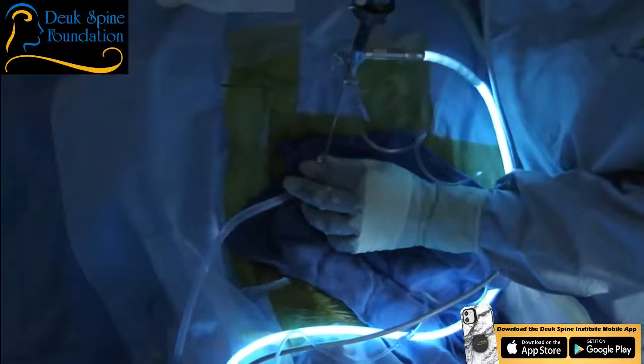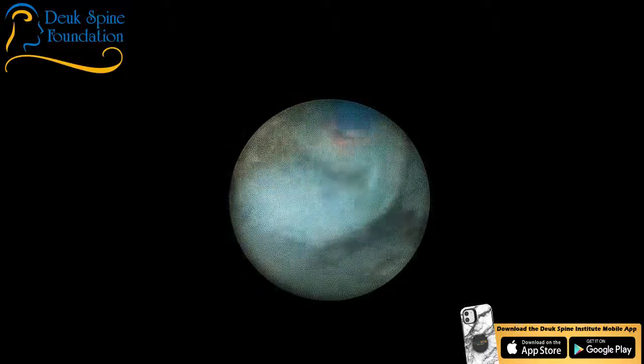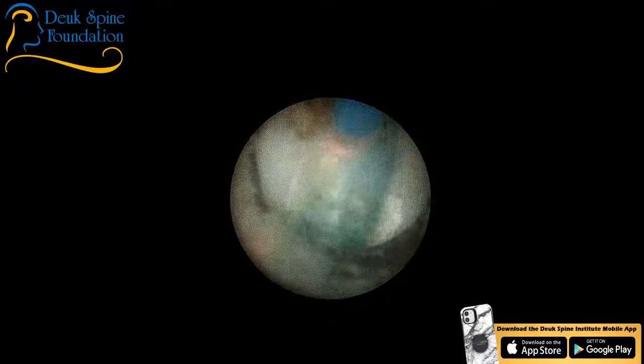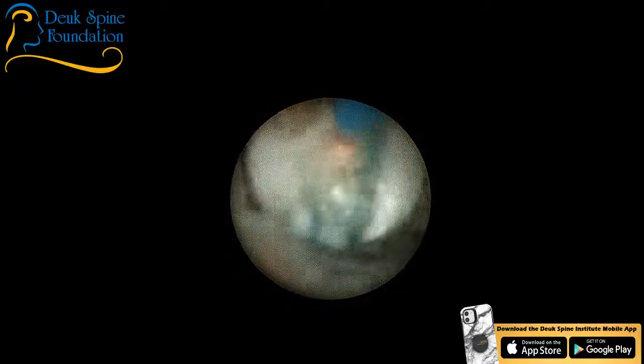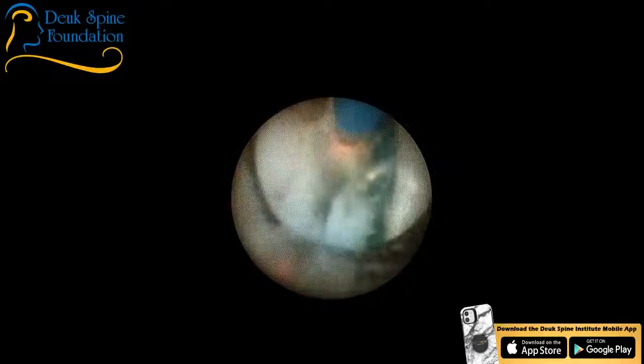So I float them up. It's called floating out technique. I developed a technique here. It's a new technique. And I just float them out using irrigation. We call them floaters. Maybe you've heard that before, but not in the medical sense.